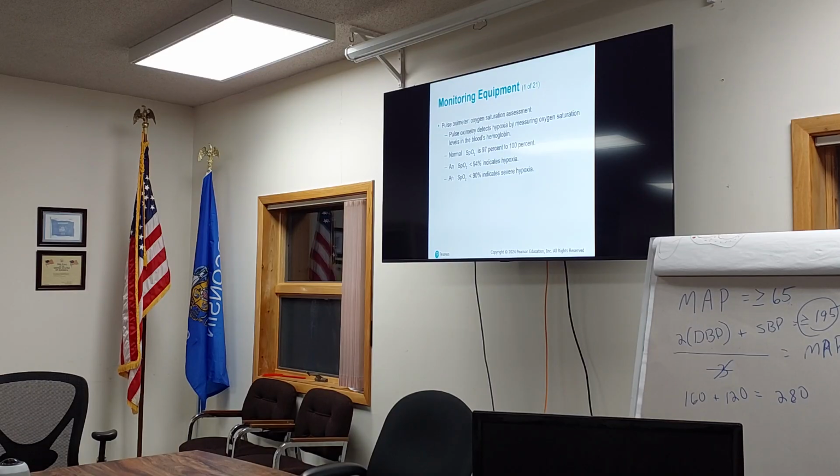Remember when I talked about you've got a red blood cell, and on that red blood cell there's another protein, right? Hemoglobin. Oxygen molecules bind to that hemoglobin molecule on your red blood cell. Really small. You also have oxygen floating around in your plasma, but what we're measuring with the pulse oximeter is what percentage of that hemoglobin is saturated, has molecules attached.